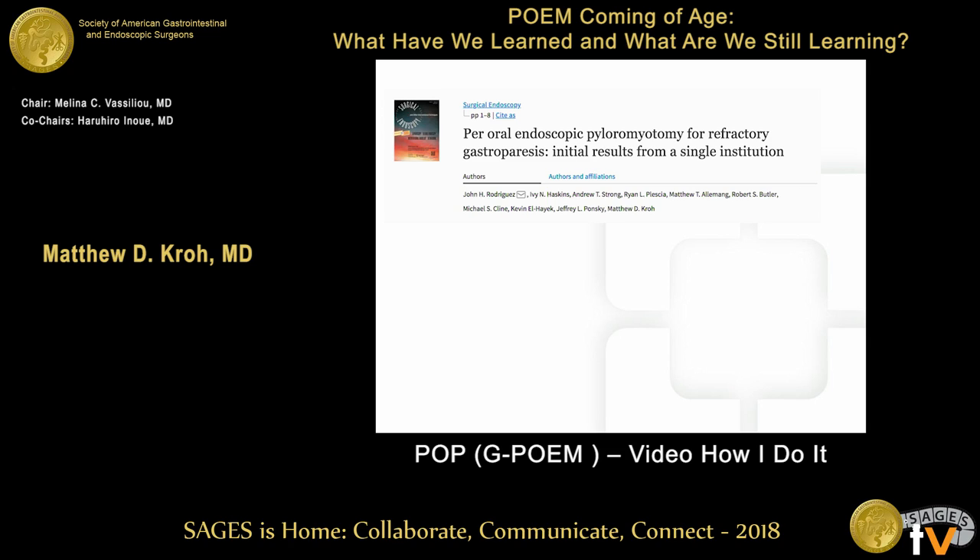I'm not going to talk about data — I have a very brief time frame here. We published our initial experience, and I'm going to show you a video of how to do this. We'll be presenting our initial hundred patients at American Surgical in just a week.